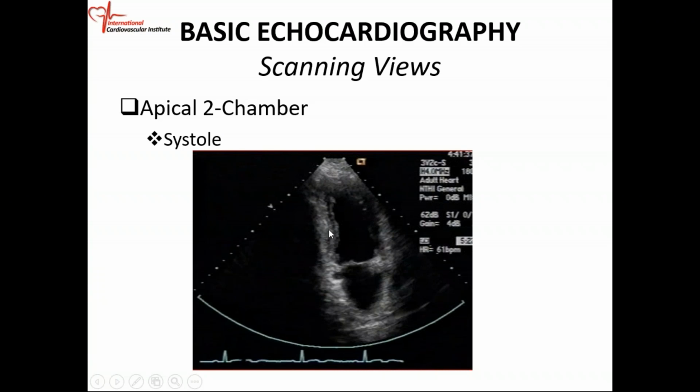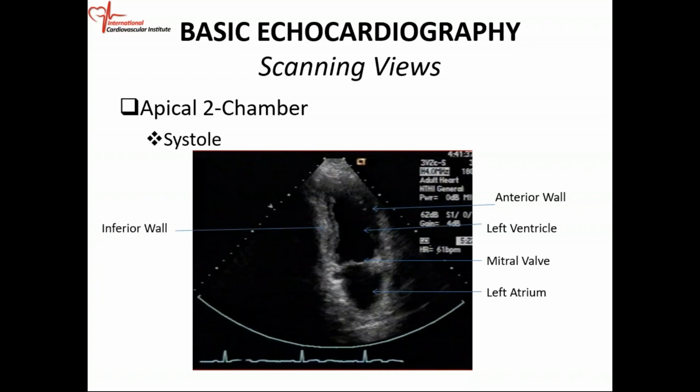This is the inferior wall now. Inferior wall, this is a very important view. Inferior wall and your anterior wall. Okay? Anterior wall, LV cavity, mitral valve, left atrium, inferior wall.